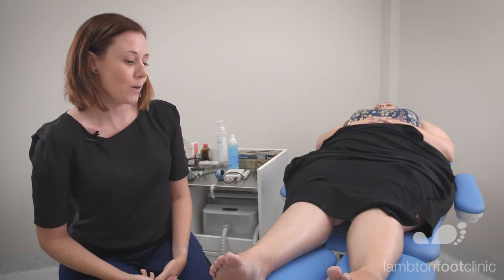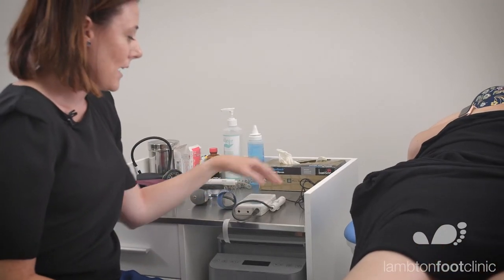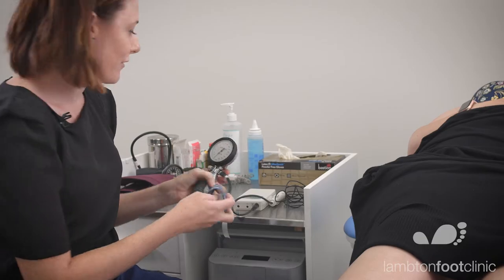So the equipment that you will need to complete a toe pressure is a Doppler unit with a PPG probe attached, and then we also need a sphygmomanometer with a toe pressure cuff.